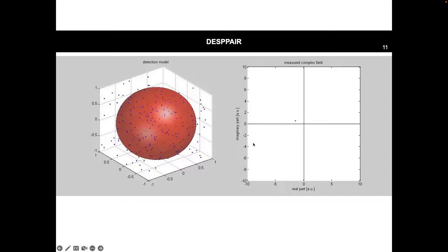particle that before the measurement is inside the sphere and after is outside the sphere. So what was the sphere again? The sphere is defined, well, it doesn't have these hard boundaries, but it's defined by the focusing of the beam. So the beam is focused, that gives you the dimensions in X and Y. And then in the Z direction, the sphere is determined by the coherence length of the source, which is the depth resolution that you have.